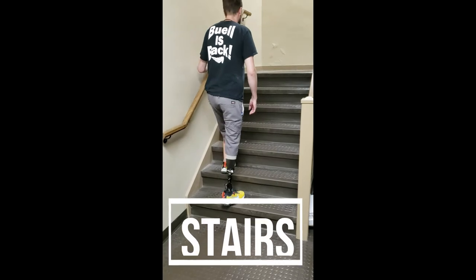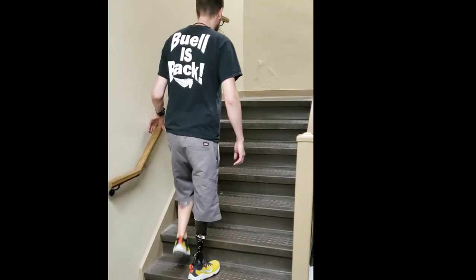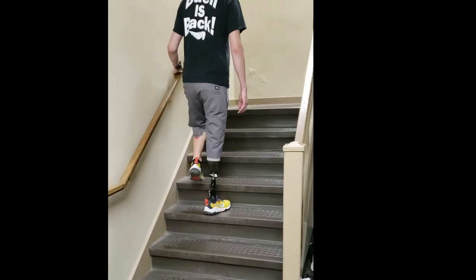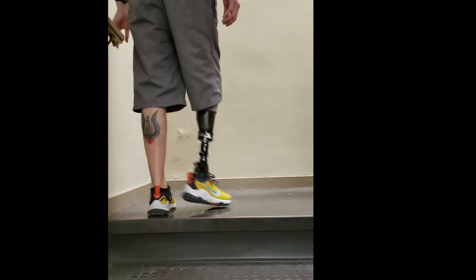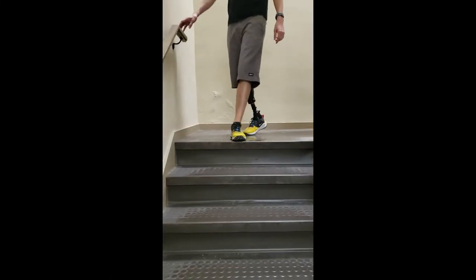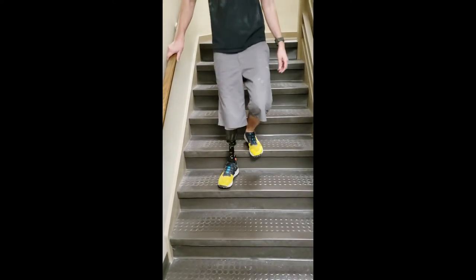When learning to go up and down stairs, the safest way to start is one leg at a time. Your strong leg goes up on the step first, then you bring your prosthetic leg up to meet it — all the way up the stairs. Hold on to the handrail as best you can, and if you're using a cane, use it in your other hand. If there are two handrails within reach, you can use both. When coming down, step down with your prosthetic foot first, lowering yourself carefully on your strong leg, one step at a time.